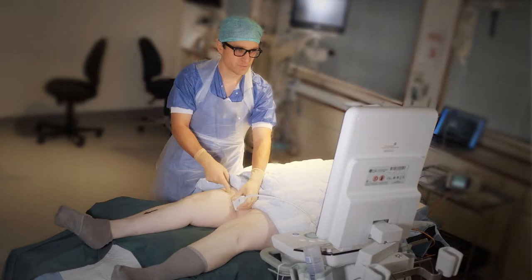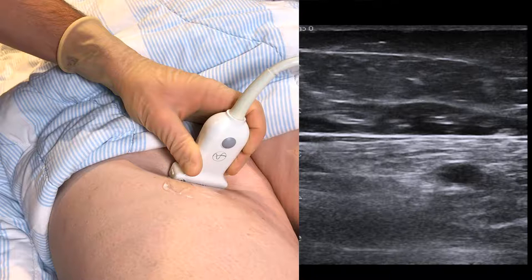The patient is placed in a supine position with the ultrasound machine comfortably within your line of sight. The saphenous is a branch of the femoral nerve that runs along the medial side of the thigh. Locate it by placing the probe in a proximal medial position as pictured. Identify the femoral artery located beneath the sartorius muscle.